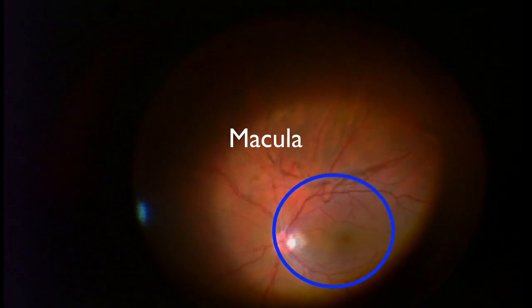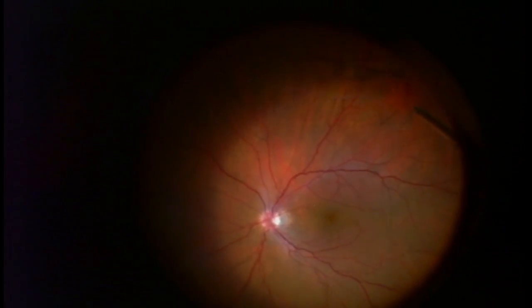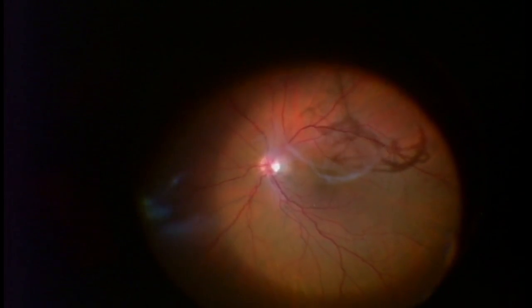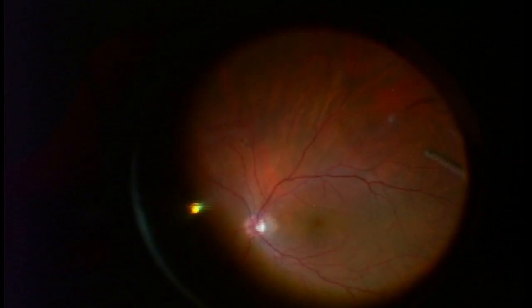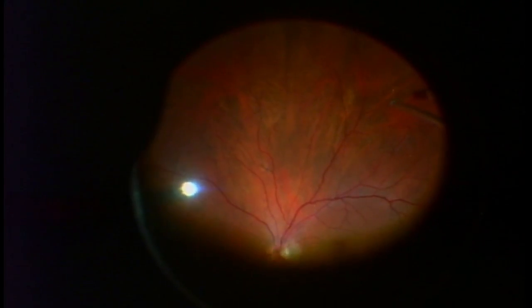There's a nice demonstration of where the macula is, which is the area of the retina that gives you central vision, your best color perception. That's the only area of the retina that gives you 20/20 vision. So again, you can see as the shadows are cast over the macula, it must have been really annoying and disruptive to her central vision.